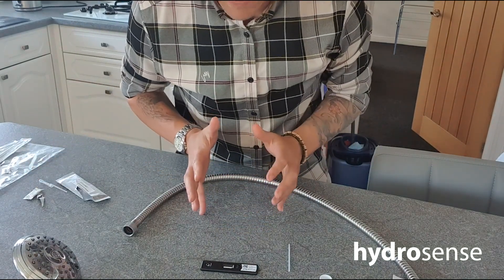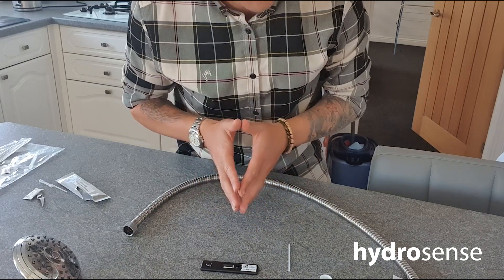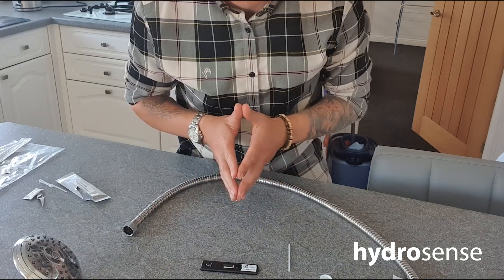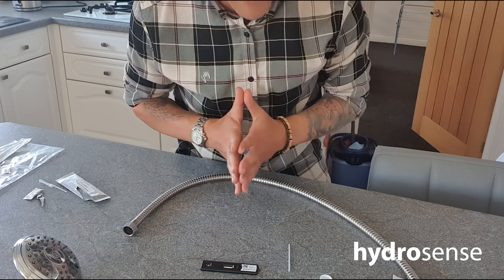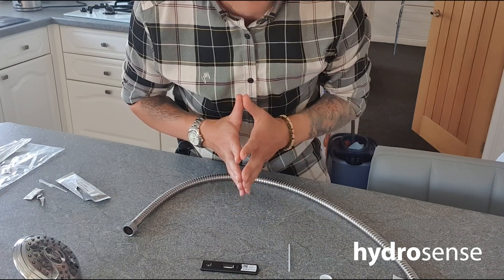Now 25 minutes later we will have a result. In the meantime, we'll go and see our technician who will demonstrate how to carry out a showerhead cleaning descale.